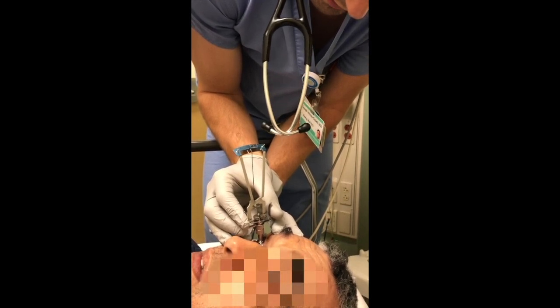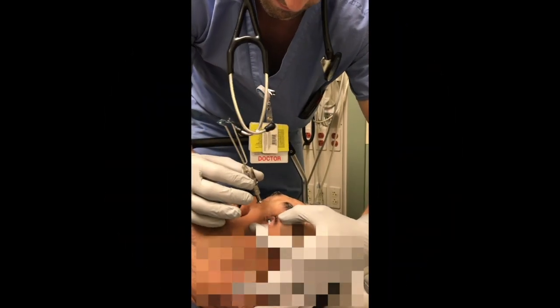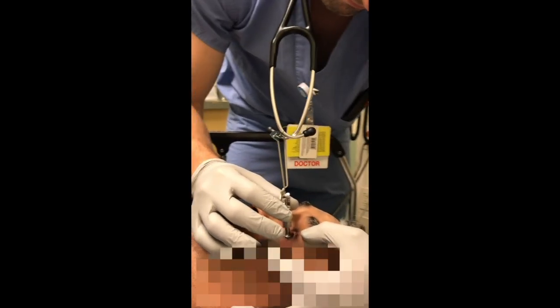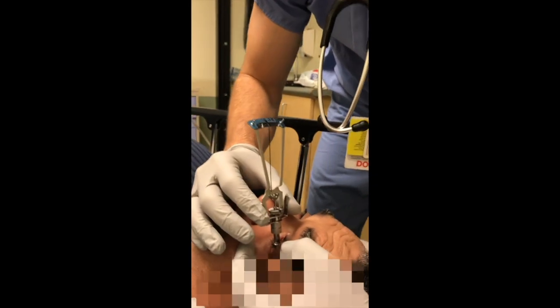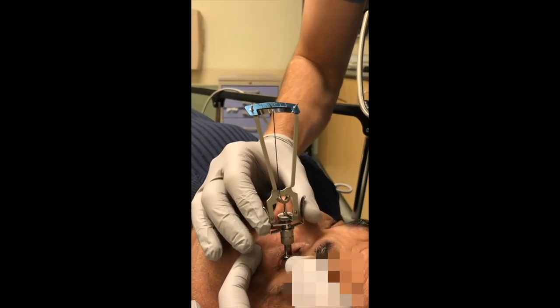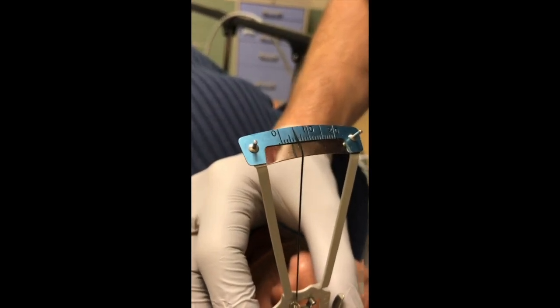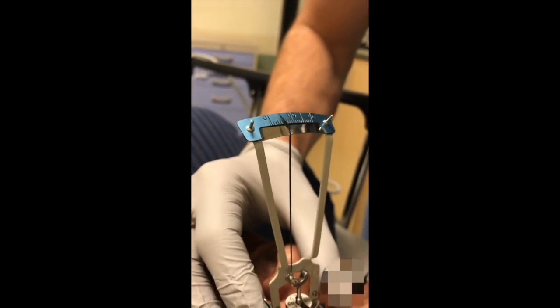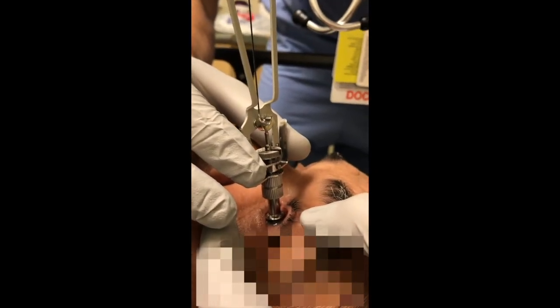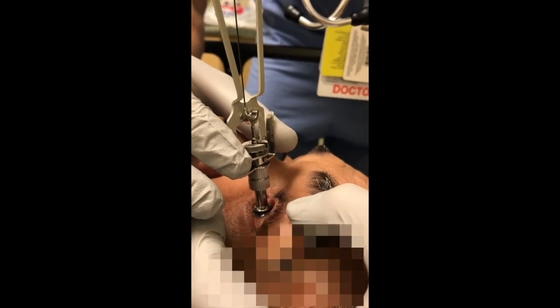You guys are reading about 5, and it's about the same — hanging out at around 5. We have the weight over the cornea, stable and supported without the eyelids, and the needle's resting right around 5.